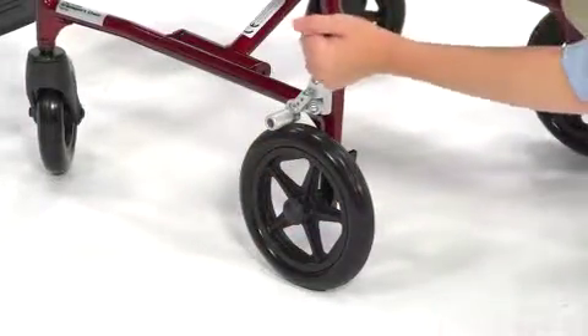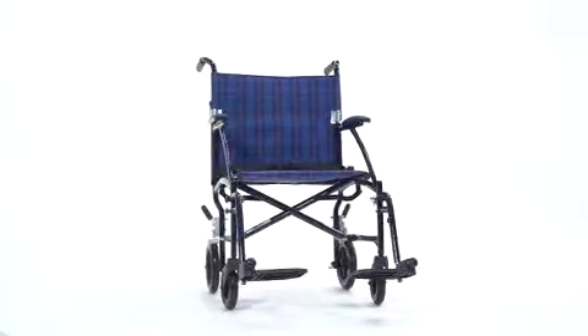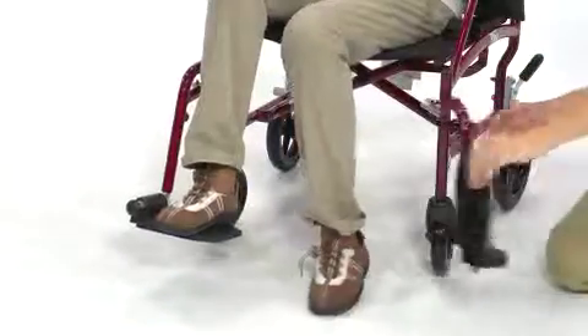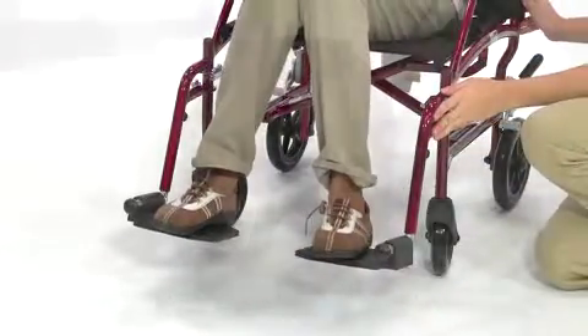When at rest, rear wheel locks secure the chair, and other than attaching the included footrest, no assembly is required. The footrests are height-adjustable and are made to swing away and flip up for ease in and out of the chair.